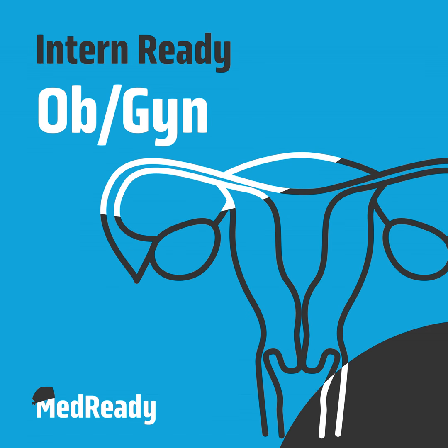An operative hysteroscopy is kind of under the umbrella of a diagnostic hysteroscopy because it's usually done after a diagnostic hysteroscopy is completed. But this allows us to address anything that we see on the hysteroscope. So if there's a polyp, we can remove it. A myomectomy, usually with submucosal fibroids, can be done hysteroscopically. A septum resection for infertility workup, lysis of adhesions, foreign body removal, so an IUD that's difficult to get out, things like that. Hysteroscopies can be done in the OR, but they can also be done in the office. We'll primarily be discussing what it's like as an intern to be in a hysteroscopy that's done in the OR.